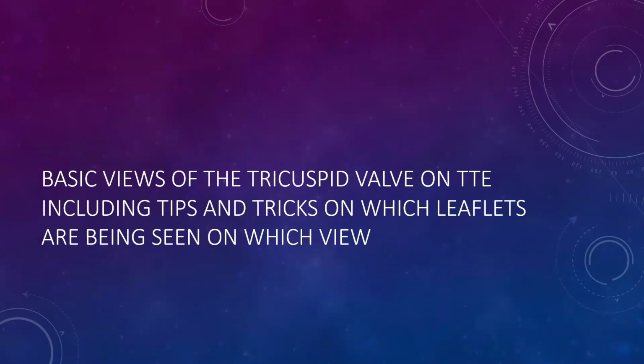Okay, I'm going to go now through the different views of the tricuspid valve on transthoracic echo and some tips and tricks to help us know which leaflets we're looking at, which views. Because like we said, the tricuspid valve annulus and the tricuspid valve leaflets don't sit all on one plane. And so depending how you're cutting the valve, you may have different leaflets being visualized.